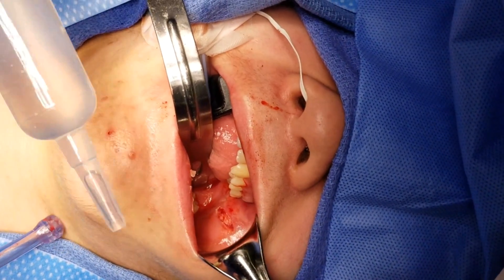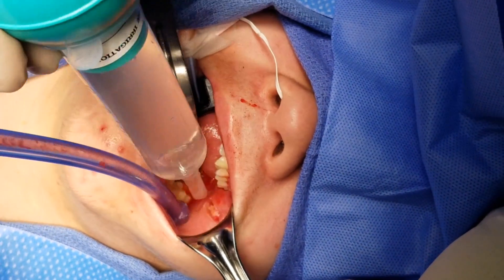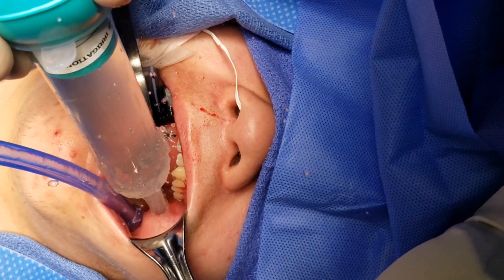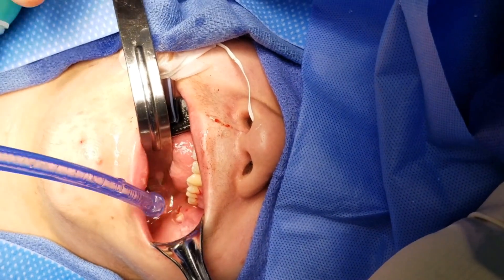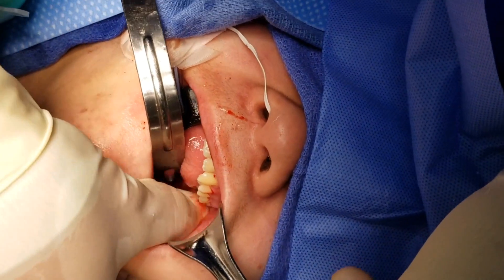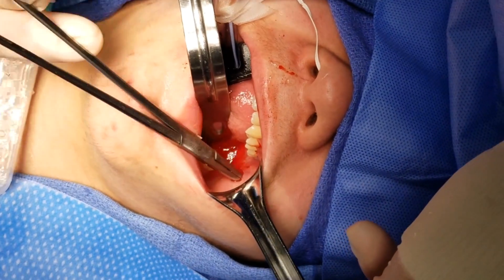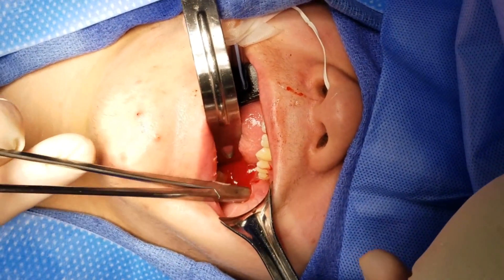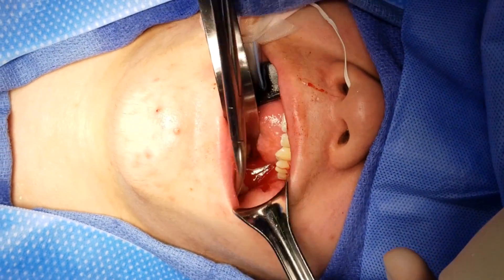Can you just suction a little bit while I'm in here again? Yeah, go all the way down. That's good. Let's get that back to you for a second. Good here. Good here. Good here. It wasn't much inferiorly on the scan.